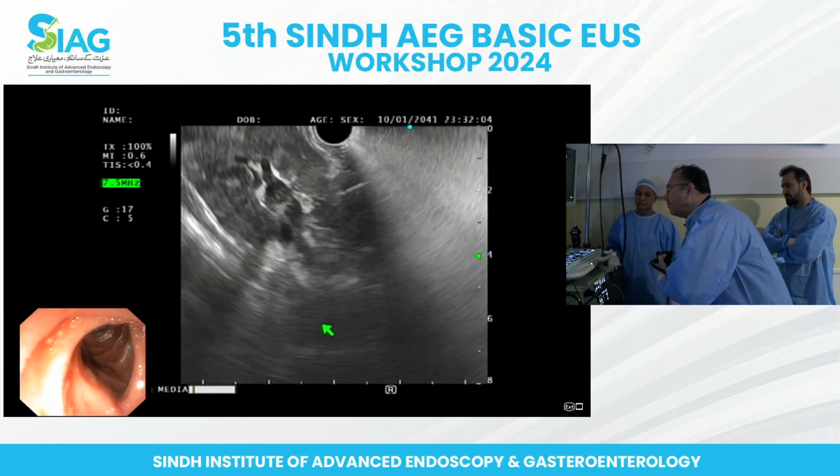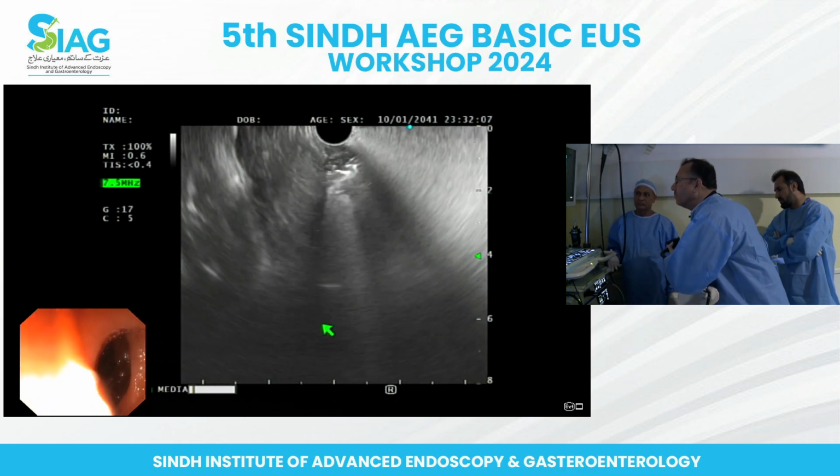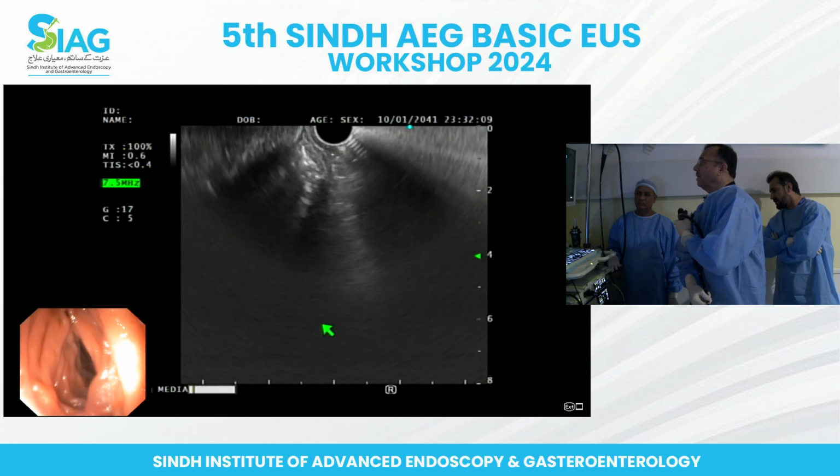And what about the perihilum lymph nodes? I think that was the indication, was it? Okay.